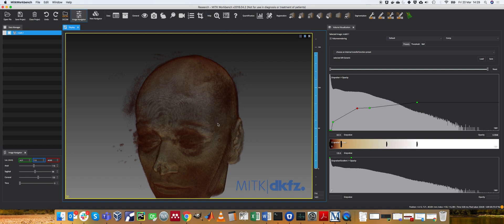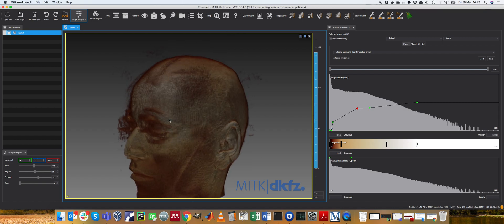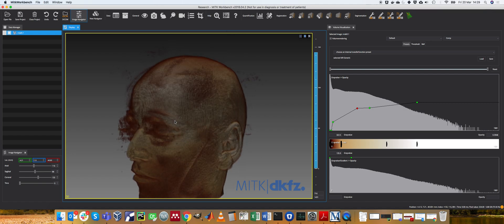But the question remains, how useful is this? How useful would this be in the operating room? This is a difficult interface to use. So it's useful for some preoperative visualization if you're trying to look at certain structures that are easily identified purely based on their intensity profile.